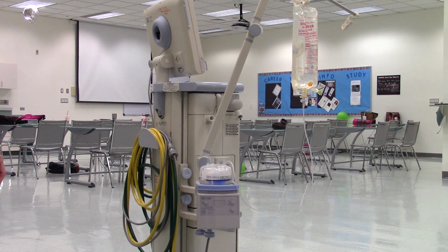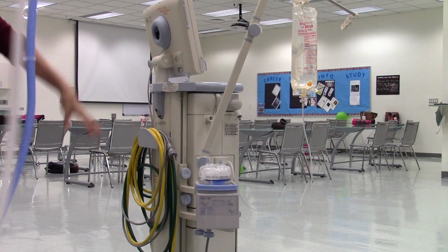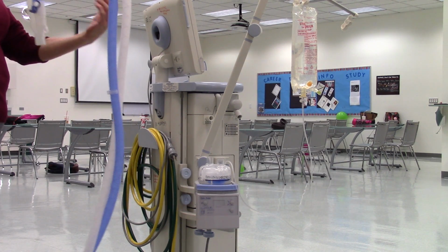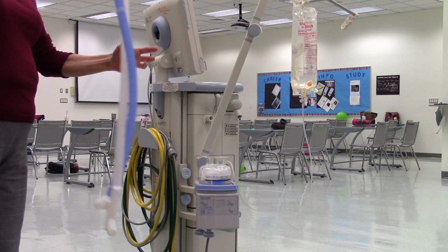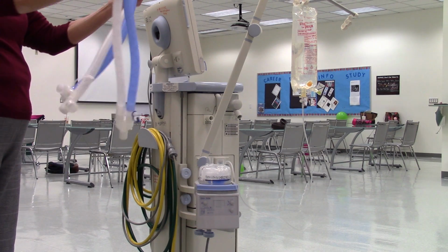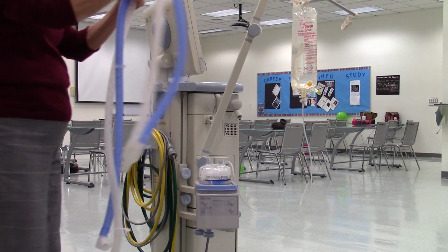Just not above. Yes. So it says, use the ventilator arm to support the tubing while you're connecting all of the tubing. This will prevent the tubing from hitting the floor and becoming contaminated. Yeah, so the circuit is long, and if it hits the floor, it becomes contaminated. If you're putting a neonatal circuit together and it touches the floor, you take the circuit and put it in the garbage. Okay. For adults, it's okay to disinfect with a high-level disinfectant, wipe it off, let it dry, and use the circuit. But better to never let it hit the floor. Do whatever you can to keep it from hitting the floor.